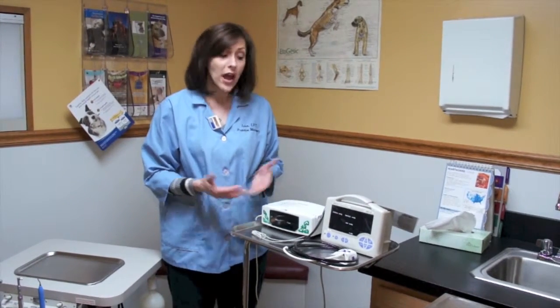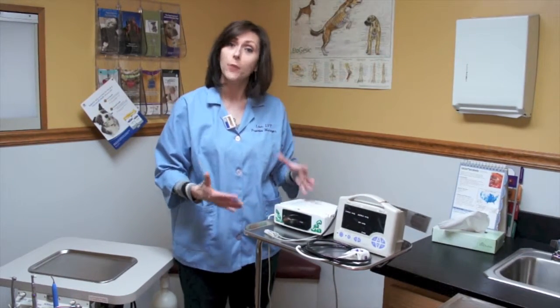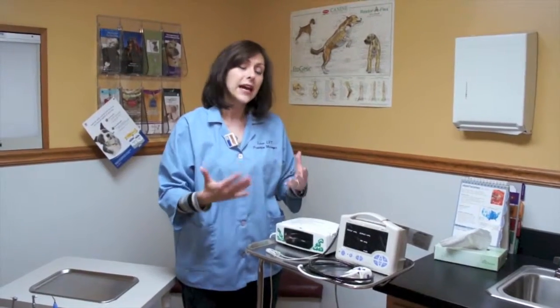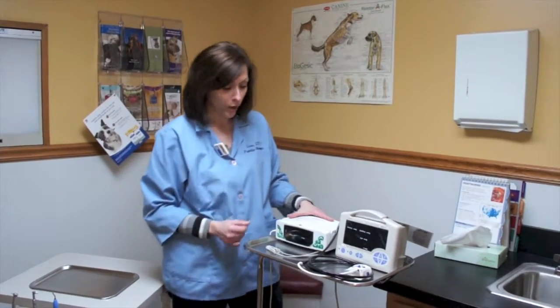During dentistries, we actually have monitoring devices on our patients. The importance of this is that patients can become what we call hypotensive, meaning they can have low blood pressure and they can also have a lower heart rate. So while under anesthetic and while performing a procedure, we have monitors to help assist us. They have alarms on them, so if anything should sound, again, not only just the monitors, yourself as the person doing the procedure can also pick up on any abnormalities that may be occurring.